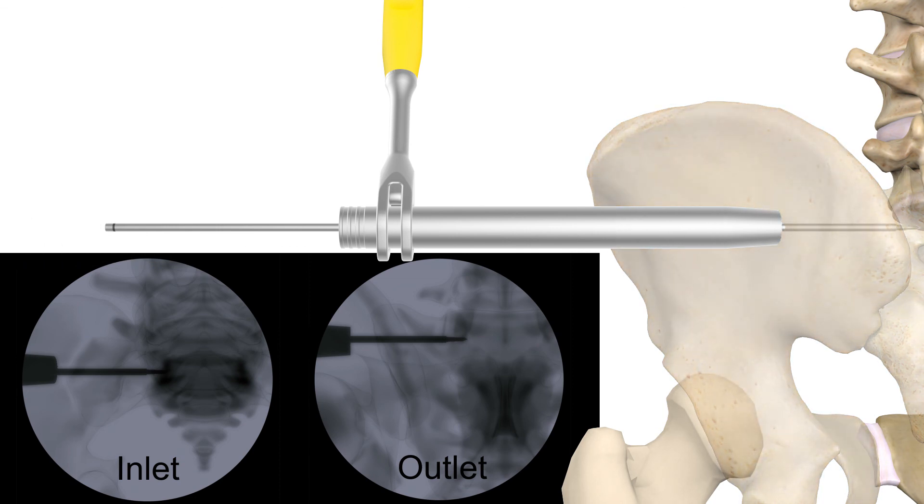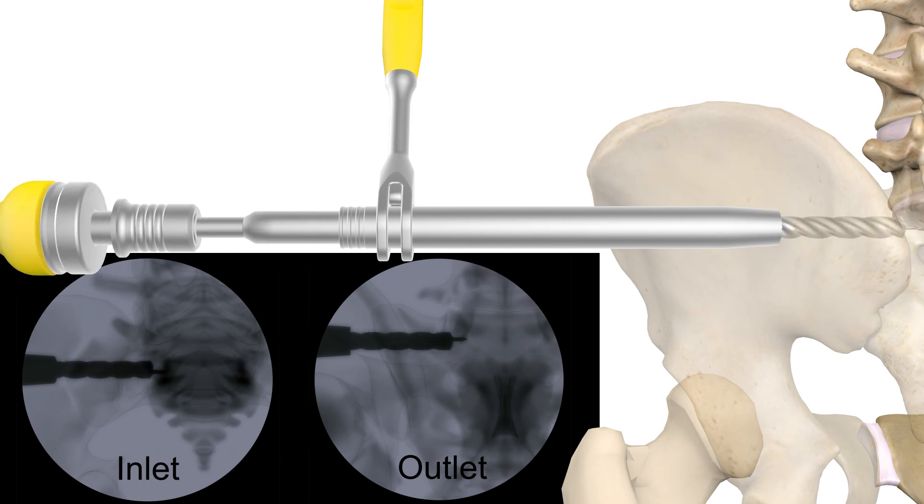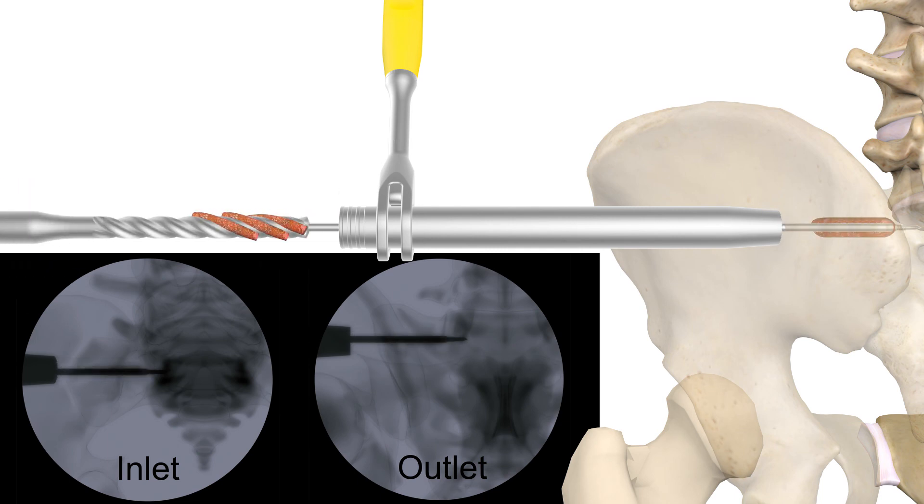Next, choose the drill for the appropriate diameter screw and, using a T-handle or power adapter, drill to the distal end of the first guide wire. Remove the drill and harvest the bone graft from the drill flutes. This graft will be packed into the implant before insertion.